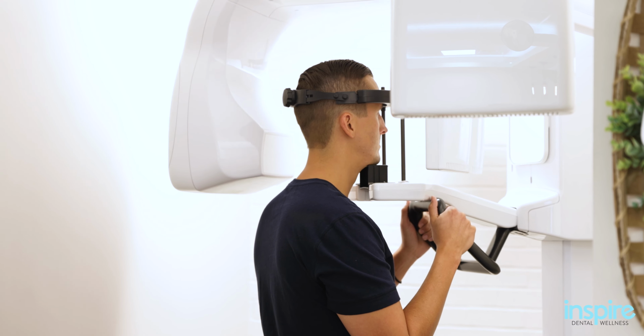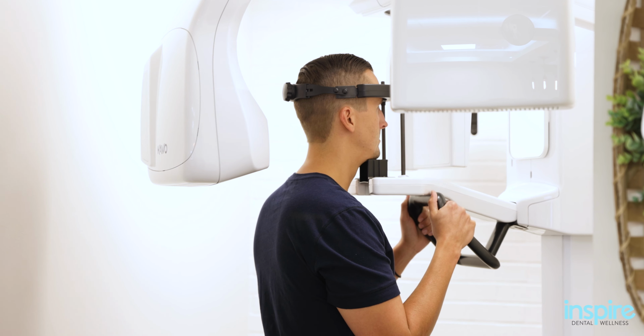For people that come in for treatment of TMD or TMJ pain or issues, like pain in your jaw, we're taking the cone beam so that we can look at the position of the jaw joints, and also at what the bone of the jaw joint looks like.